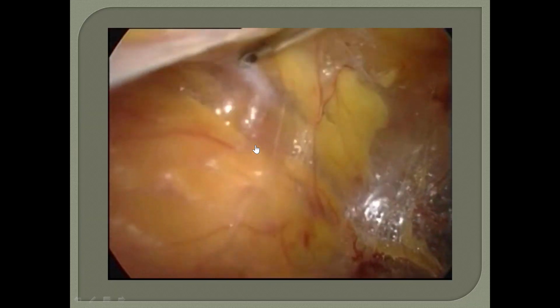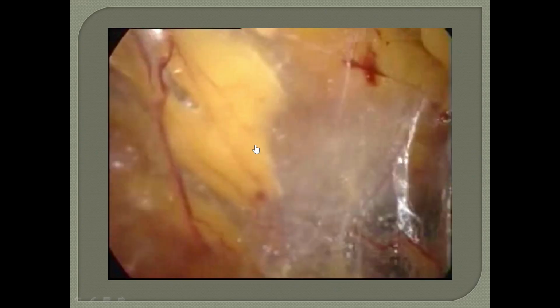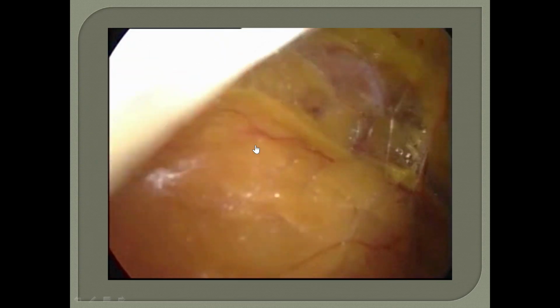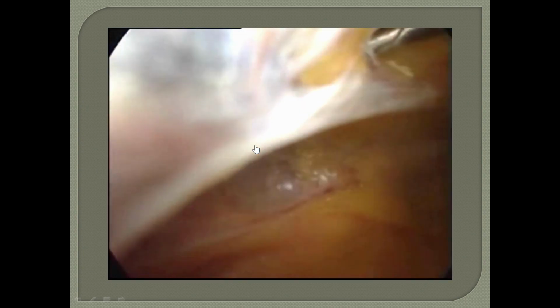When you see the epigastric, you have to let the epigastric attach to the abdominal wall. You do not have to go there, because if you go there, you will detach them. You have to go under them. And if you go under them, then immediately you will find the muscular part, the transverse muscle, and immediately you will find this.